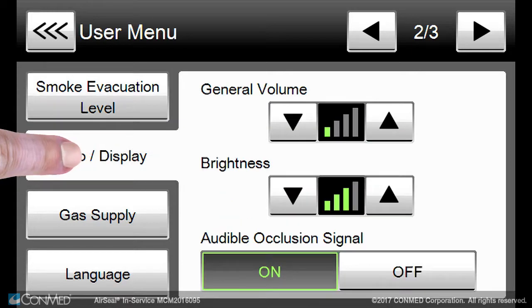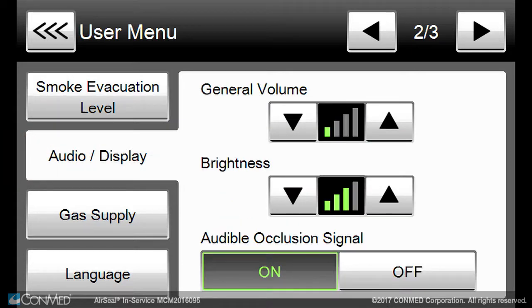You can set the general audio level, the touch screen's brightness, and whether the audible occlusion signal is on or off.